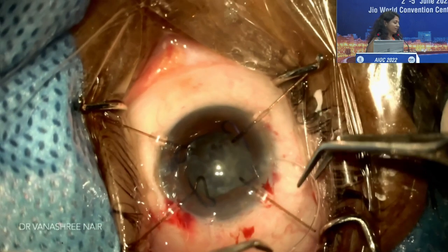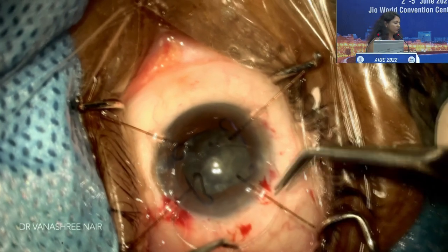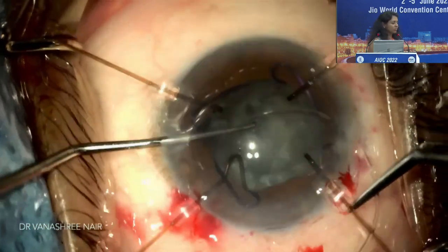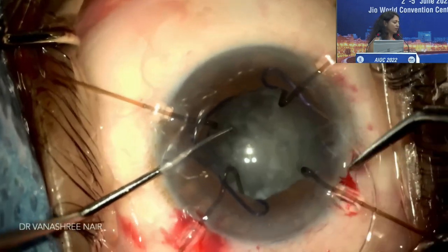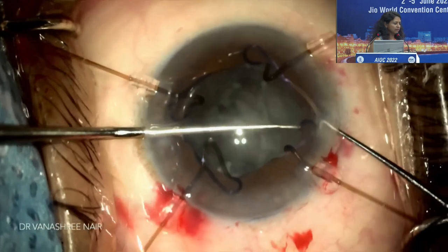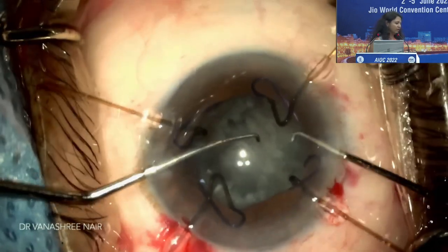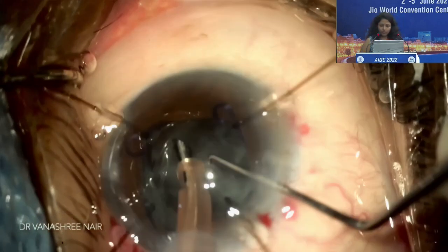At this point I thought, let me go in with the CTR and stabilize the bag horizontally, and then go ahead with the phaco emulsification, because I knew I was going to struggle with nucleus management. Being a softer cataract, I'm not getting two halves or multiple cracks. So I first inserted the CTR. Here I had to be careful because my capsular hook was probably going to get entangled, but luckily there was no complication there. Can you just pause the video here?